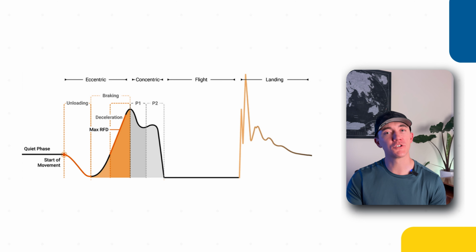If you're wanting to use force plates either in a rehab or performance-based setting, you have to understand how to read a force time curve. The force time curve is the graph that tracks the forces being put into the plates, and if you don't understand how to interpret the graph, you're gonna get lost.